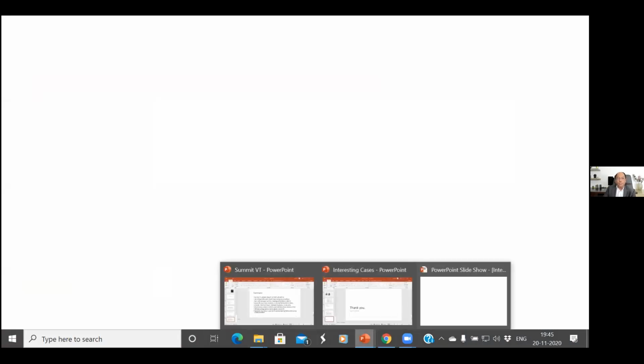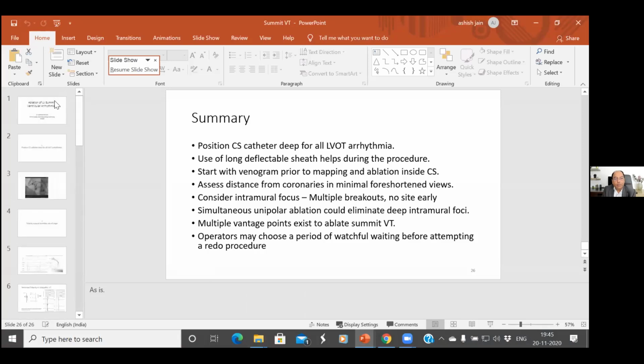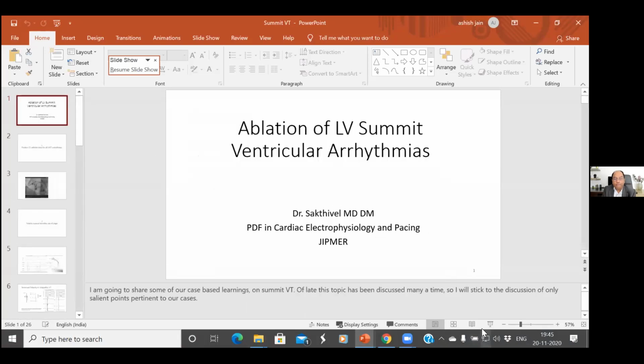I don't think it will help. That's typically useful in AF ablation where we are trying to create transmural lines of ablation. But here we are dependent on the electrogram and we just want to ablate the pathway and we are basically monitoring it by the conduction process. Fine. I don't think we need that probably.